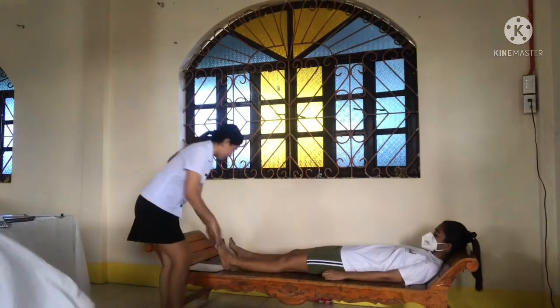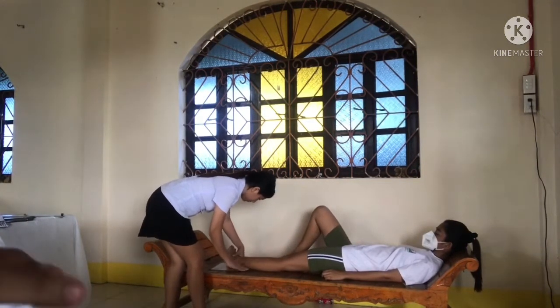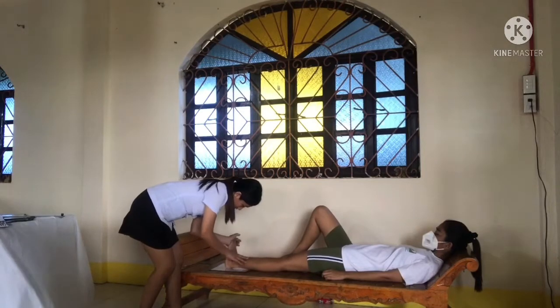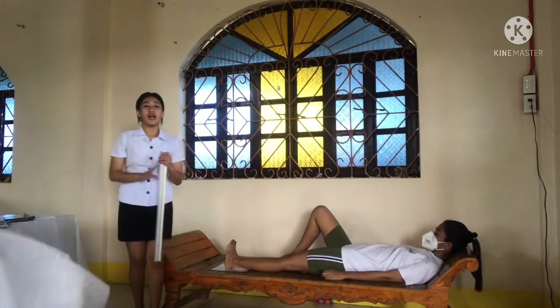Assist the patient by internally rotating the entire leg and foot together 15 to 20 degrees until the intermalleolar plane is parallel with the IR. So the plantar surface of the foot should be placed at a right angle to the leg. So the central ray for this projection is perpendicular, entering the ankle joint midway between the malleoli.